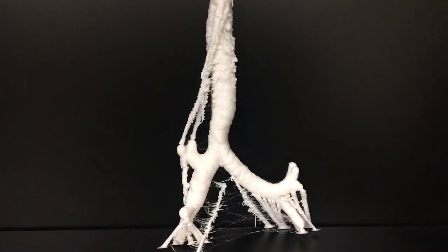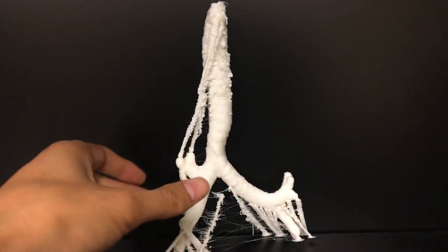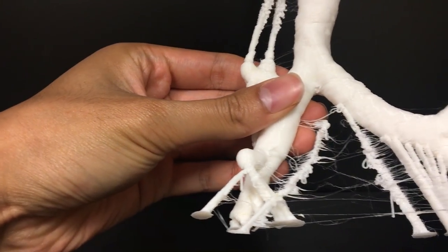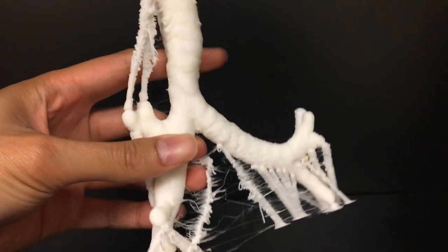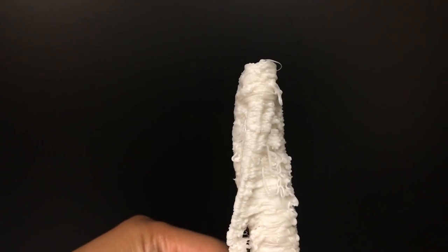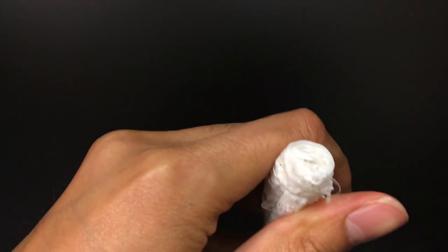Okay, I have pulled the airway out of the printer, and this is the result. I haven't done anything to it, I just cut it off the bed. So as you can see, the supports are still on. The model turned out fairly well, except for up here. Up here it got a little bit crazy, just because I think the geometry got pretty small, and NinjaFlex has a hard time rounding some very small corners. But the model turned out pretty good.